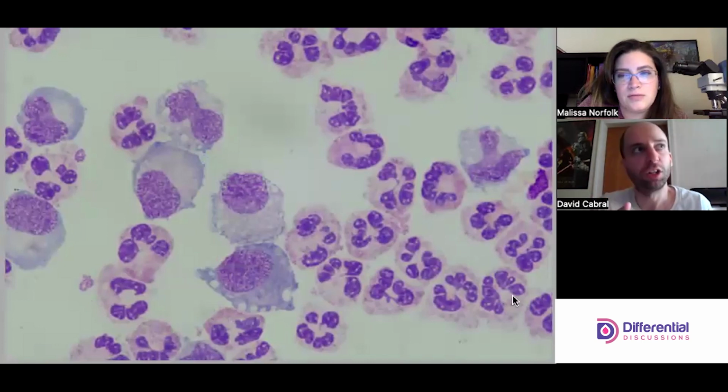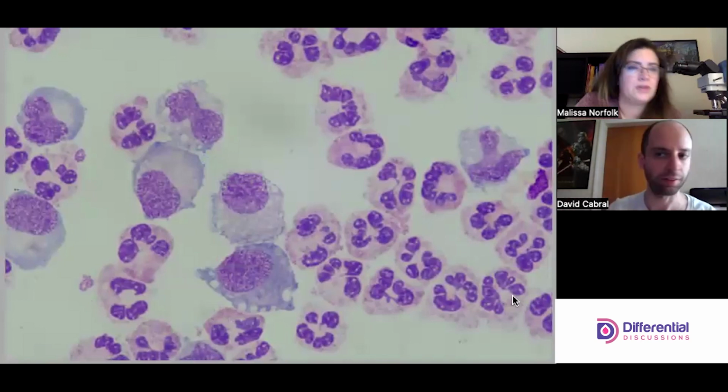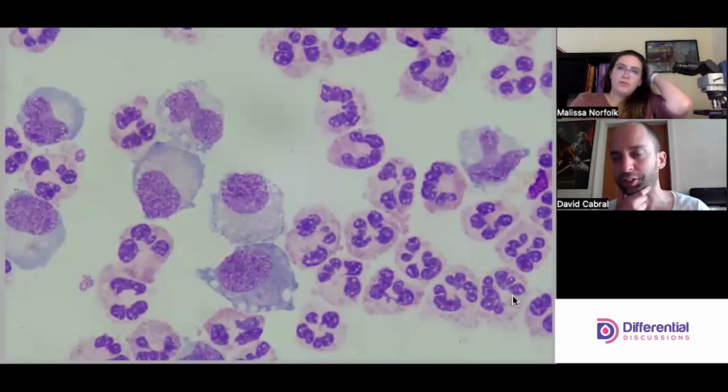And then also think about clinical utility here. We could all just spend hours agonizing over a single cell. An extra lining cell or one less lining cell in the differential is not going to influence the clinician's decision, because again, we're not typically looking for malignancy. Malignancy is what you worry about in pleurals and things like that.